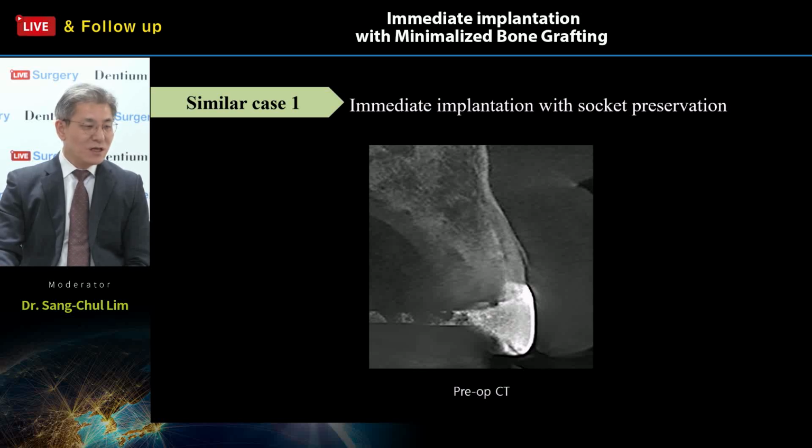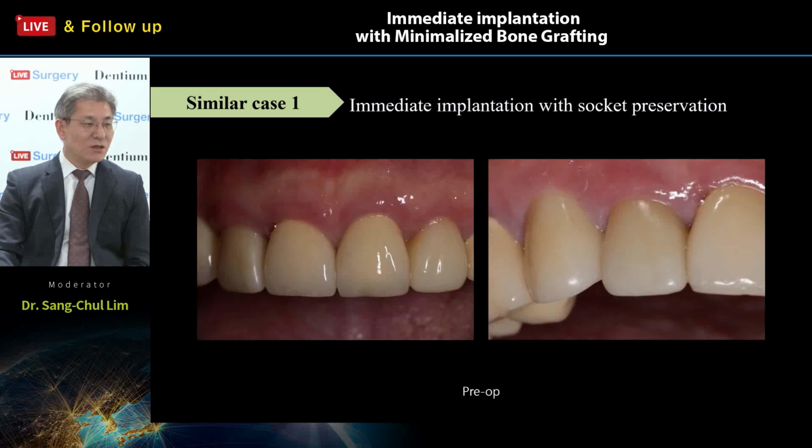So the cone-beam CT is here. The labial bone plate is so thin, right? So after extraction, we're going to check the osteotomy direction for preserving the labial bone plate, for long-term stability after implant insertion.